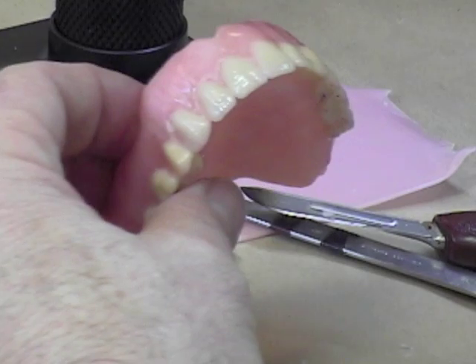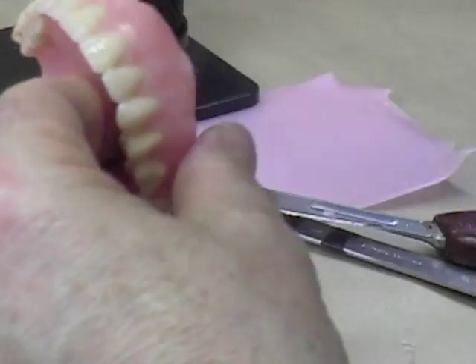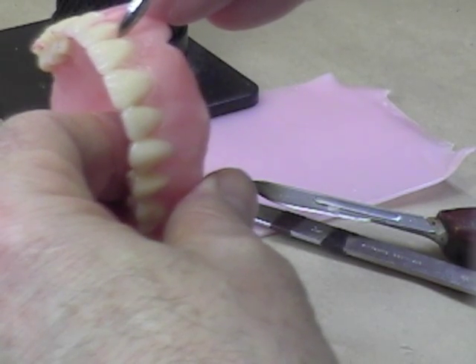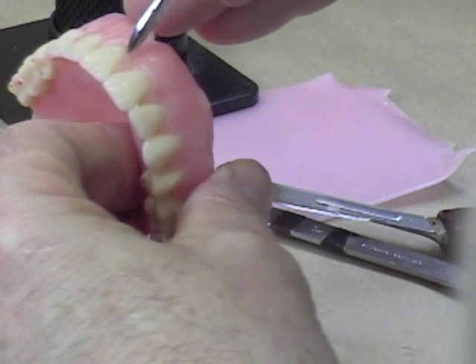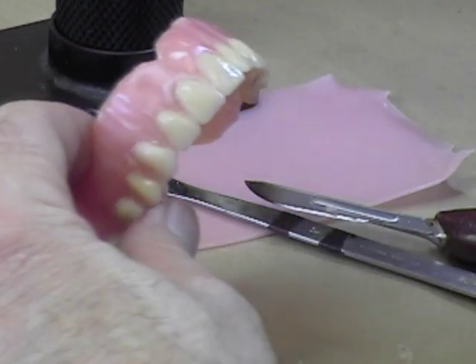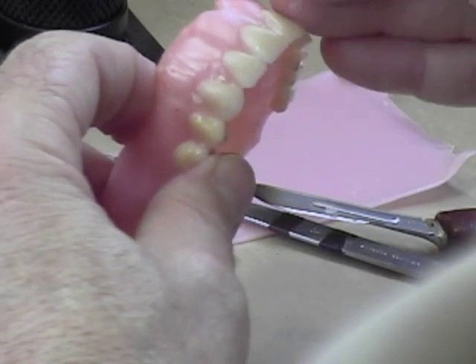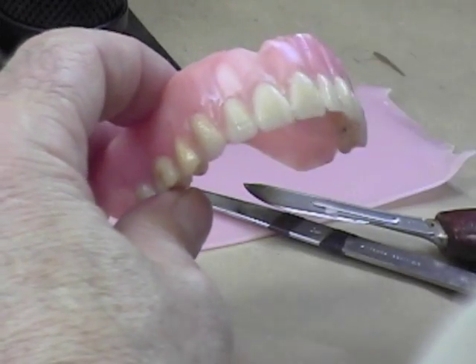The other thing you want to do — and it depends on how artistic you want to get — is that if you look at the gingiva on a natural dentition, you'll find just a very slight roll of the gingiva just as you come to the cervical neck. One of the things we can do is add a little bit of extra wax to make it a little bit more natural, and you can blend that in to make sure it's nice, smooth, and continuous.